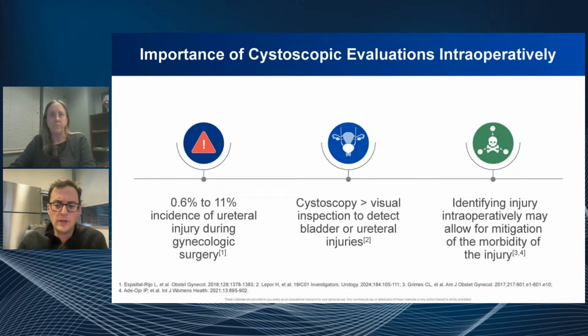And a lot of what we do in urogynecology, for example, and that's a hat that we both share, has to do with the ureters and kinking or blocking of ureters. So visualizing efflux after a surgery has been completed actually gives us a lot of reassurance that things are okay and the patient's not going to have an issue post-operatively. The reason it's so important is there is a lot of morbidity that can come from unrecognized ureteral injuries and bladder injuries, for that matter.